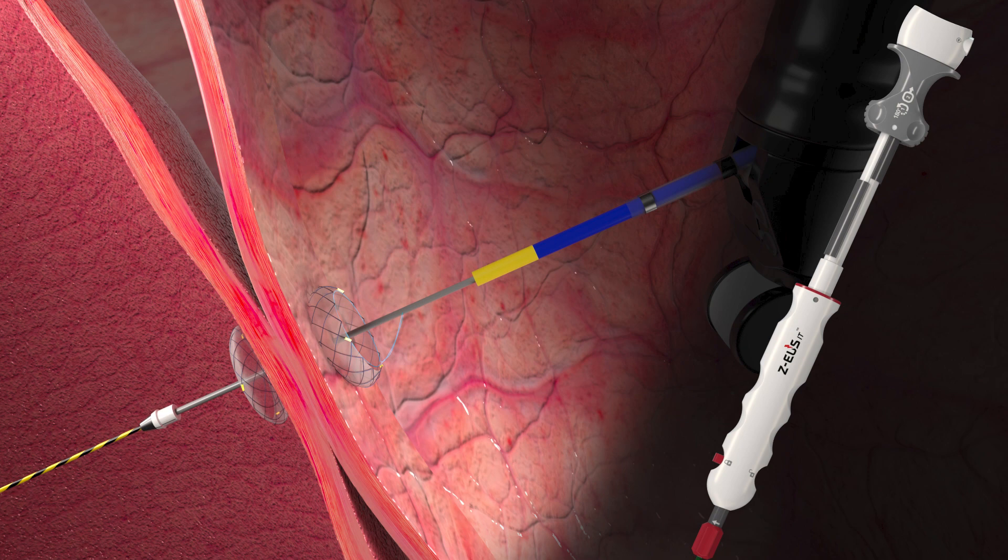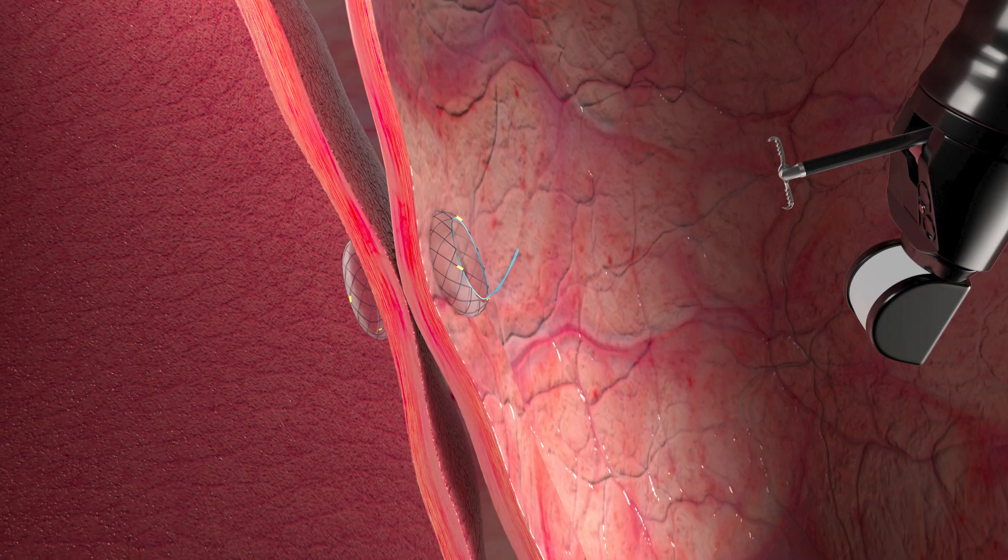Check that the stent is properly positioned. Unlock the luer lock counter-clockwise and remove ZEUS-IT. To remove the stent, pull the lasso on the stent by using alligator forceps or a snare.